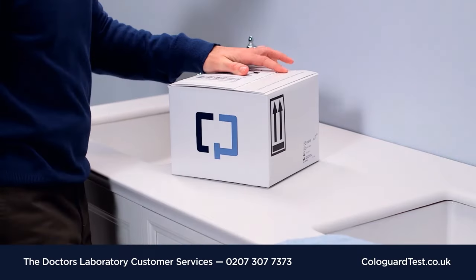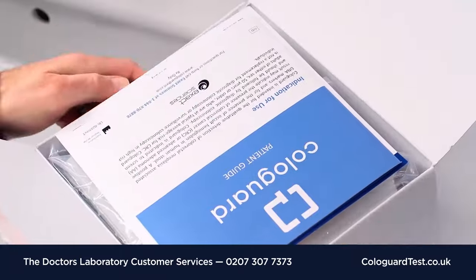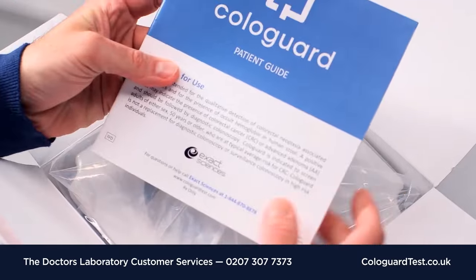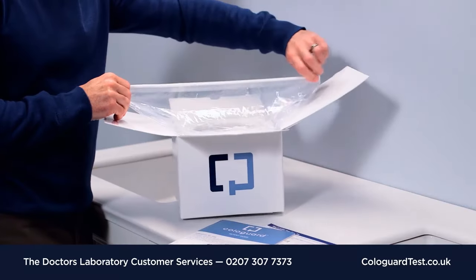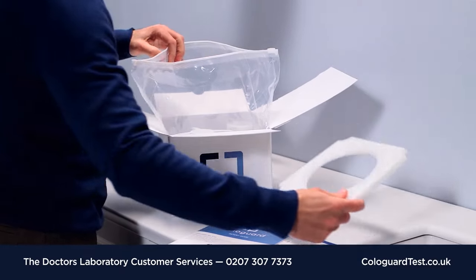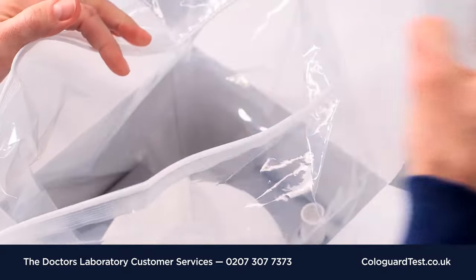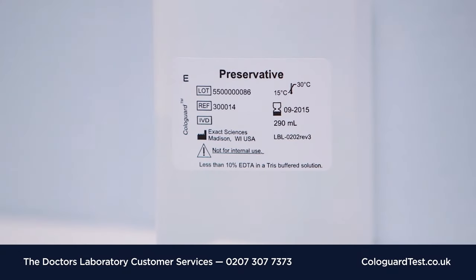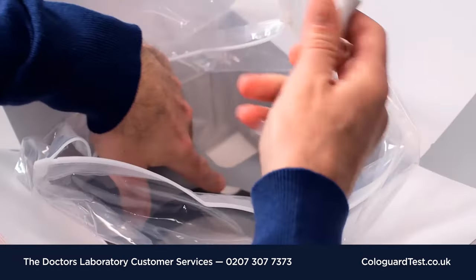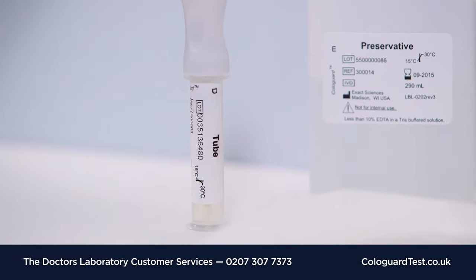Now let's take a look inside the Cologuard box. For more detailed instructions on how to use Cologuard, please use the patient guide. Open and unzip the plastic bag, pull out the contents, but be sure to leave the bag attached to the box — it will keep your kit secure in transit to the lab. Once you're ready to have a bowel movement, Cologuard is ready to use.